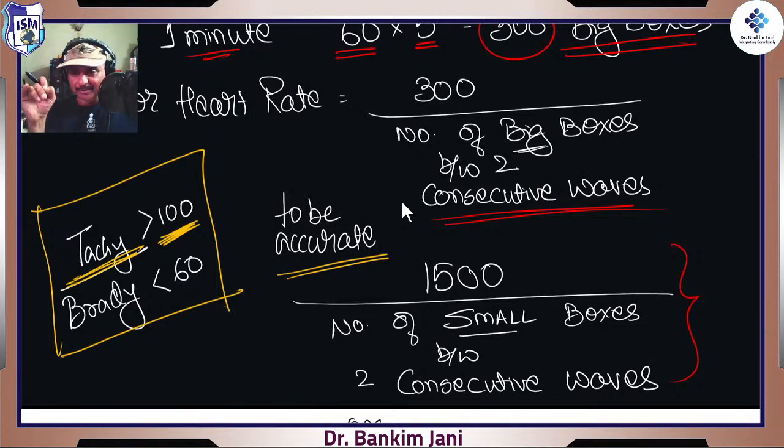Then you might ask a question: if it is universal, then why are there settings such as 50 mm per second, etc.? It is because in some cases, when the heart is going at a very high pace, you really want it like during an investigation, when you really want to interrogate a person, you put a camera. He is getting shot with those high speed cameras, which have a very high frame rate. And then when a question is asked, you go at slow motion, right?